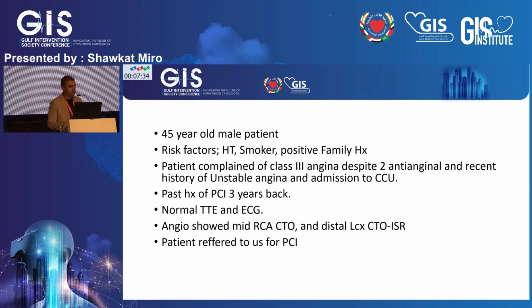The patient had a history of PCI 2 times before, PCI to the LAD and circumflex 3 years earlier. Echocardiography on admission at that time was normal, with a normal ECG and angio performed 1 month back. It showed a mid-RCA CTO with distal LCX CTO ISR.